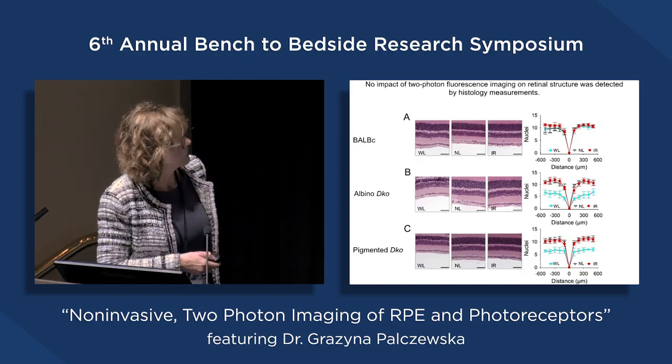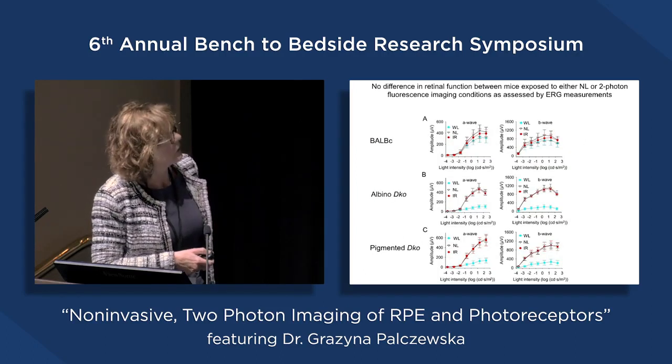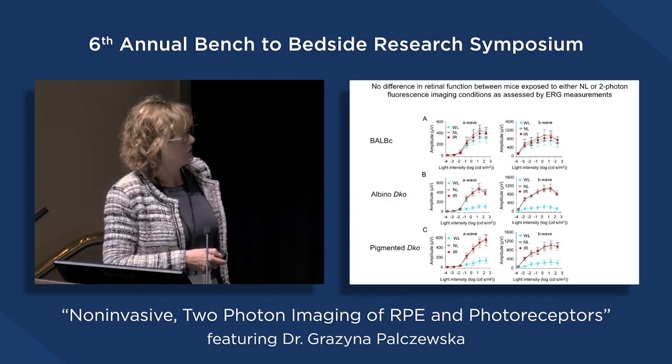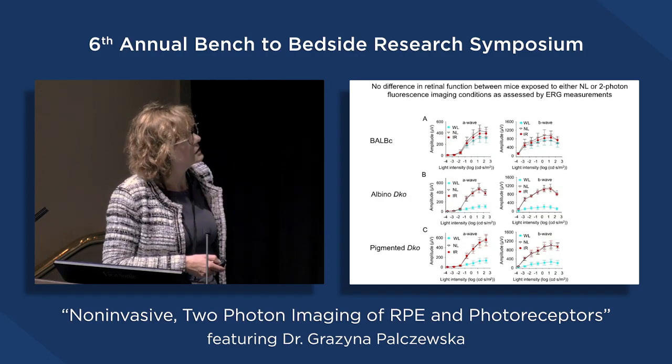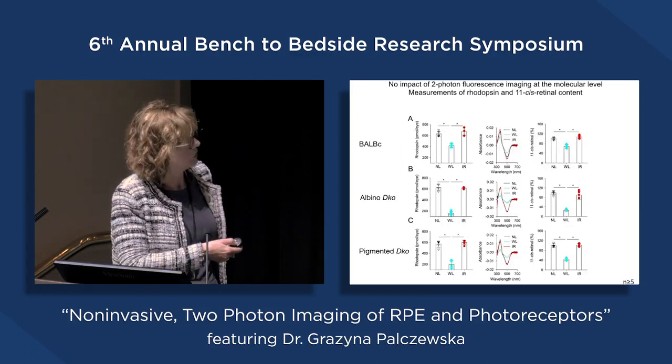And we confirm this also by the histology and by the functional measurements. By the ERG measurements, there were no significant differences between mice that were not exposed to light and were exposed to the infrared light for the imaging conditions.